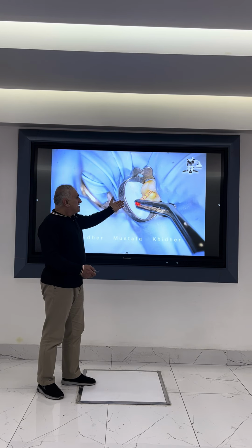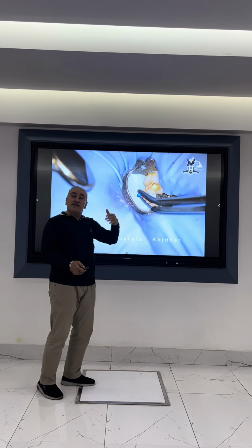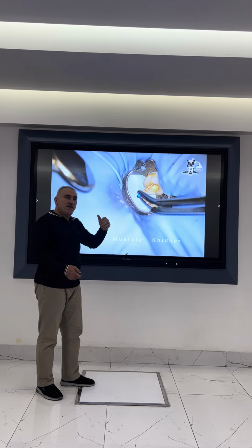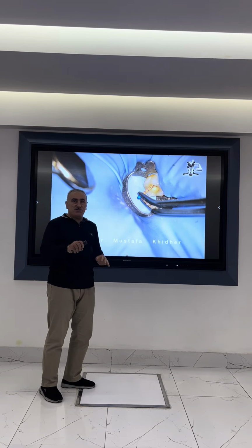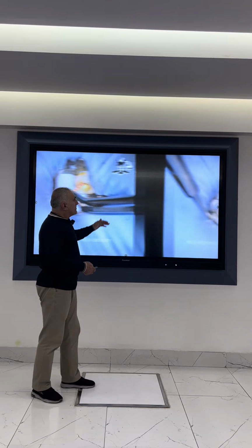Then I check the distal canal again. Here again I should also check the distal canal for a larger size. If the larger size is suitable for the canal, at the full working length, I choose the larger size, based on the rule of maximizing the cone and minimizing the sealer.